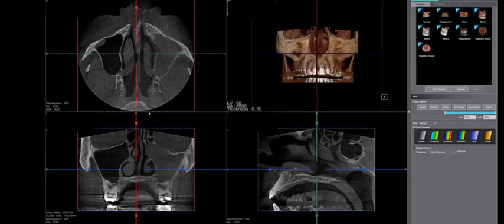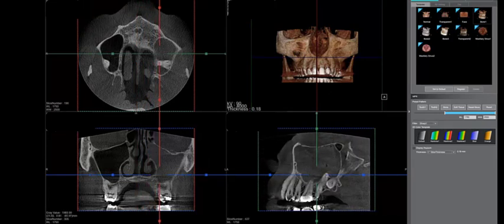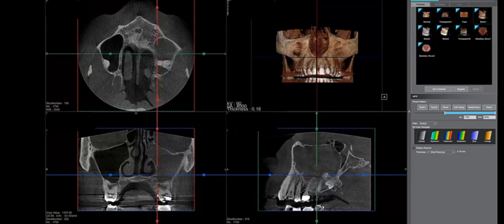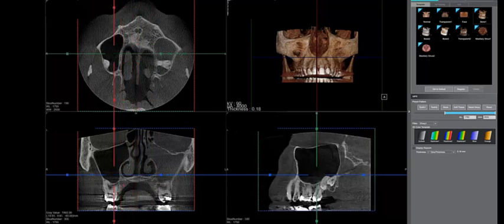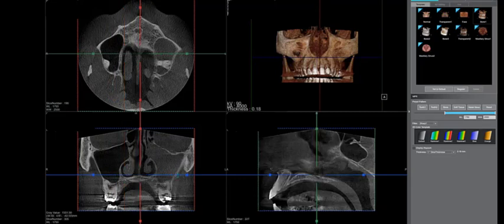Okay, so this particular patient just came in for a routine periodic exam, and one of his concerns was that he'd been having some sinus troubles. His sinus hadn't felt quite right, so we took a volume on him, and as you can see, his sinus is entirely occluded in a variety of directions. It was nice to be able to take that sinus view and show him, hey, something is going on. You should probably go and visit your ENT. So he actually went and visited his ENT and got worked up, and the ENT took care of him, and he feels a lot better now.